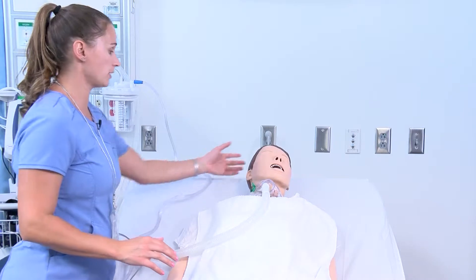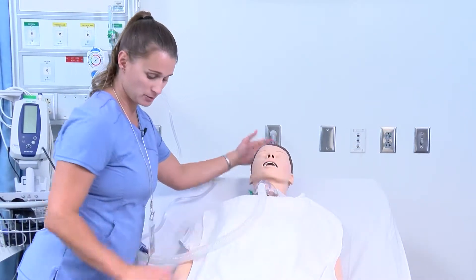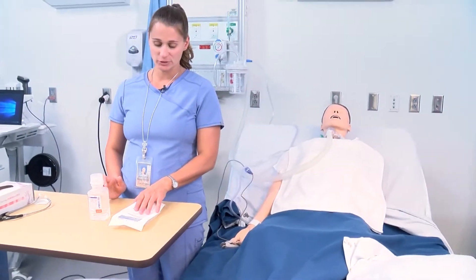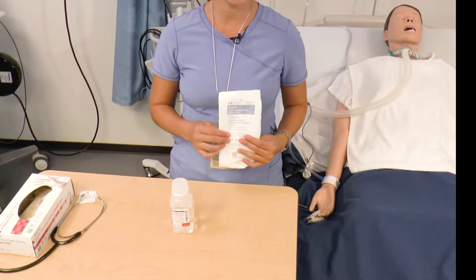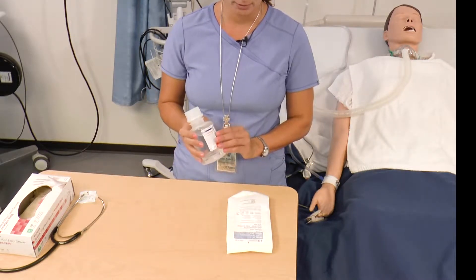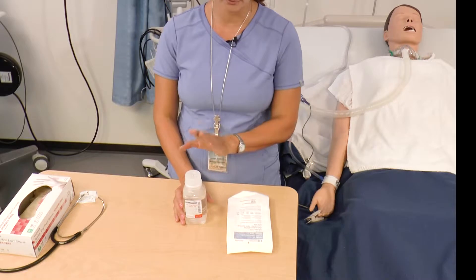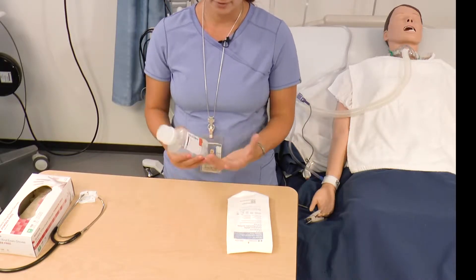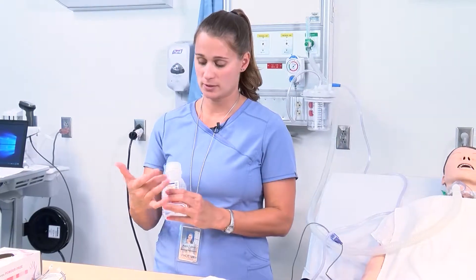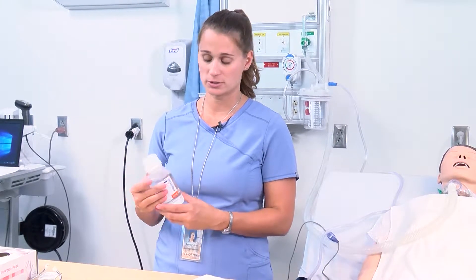If at any time you are uncomfortable, please let me know and I will stop the procedure. For this procedure we're going to be using a suction catheter kit and normal saline. This is a brand new bottle, but if I were to open it and wanted to reuse it, I would date, label the time and date, and discard within 24 hours.